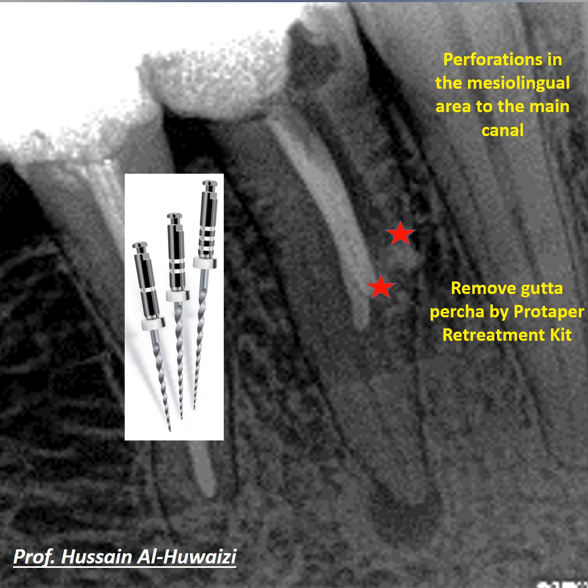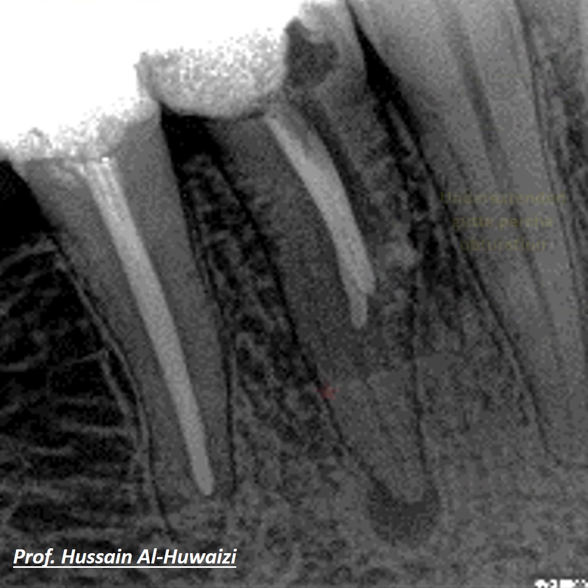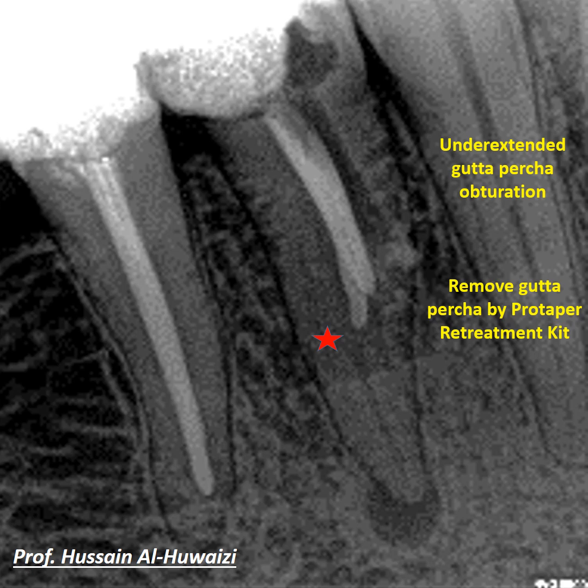Removal of the gutta-percha was performed using the ProTaper retreatment kit, with the three instruments used one by one, followed by copious irrigation and cleaning with sodium hypochlorite and EDTA.